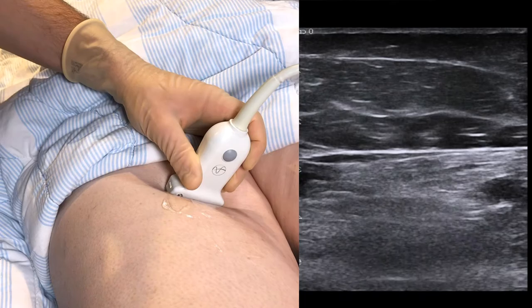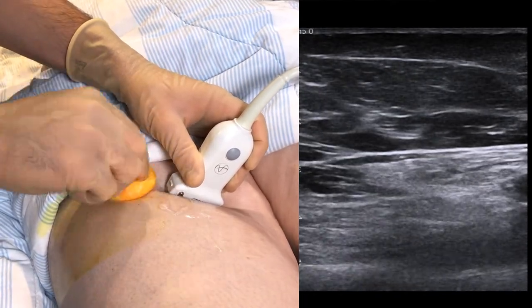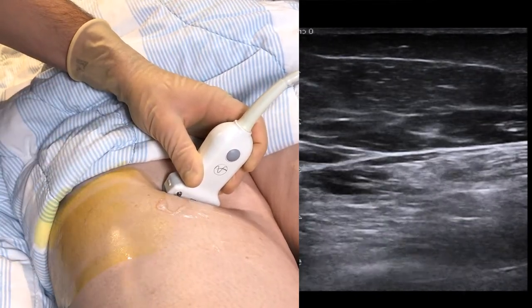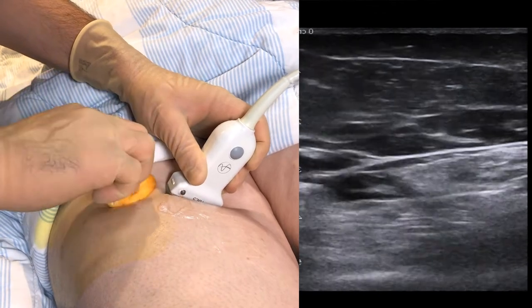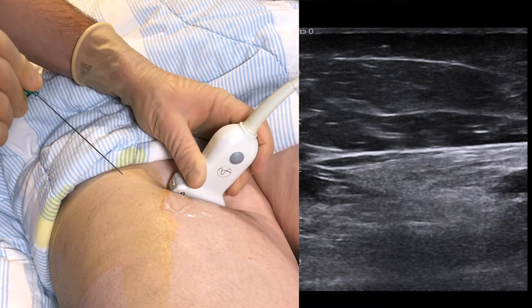Prep the area with an antiseptic solution. Do not move the probe and ensure you keep a distance between the edge of the probe and the insertion point in order to keep the procedure sterile. We find that a 10 cm needle is sufficient.